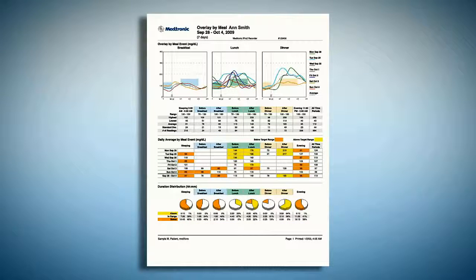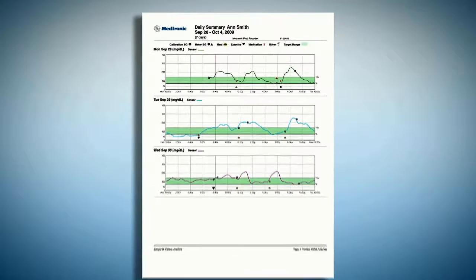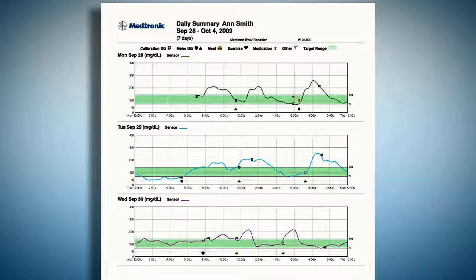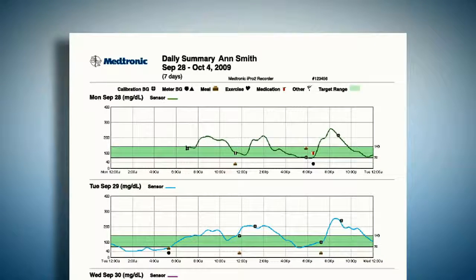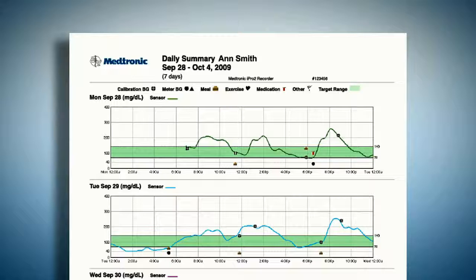The third report automatically generated is the Daily Summary report. This breaks out each individual day of the iPro 2 evaluation, showing the sensor tracing along with event markers for meals, medication, activity, and other. Here you can see the event that we entered for Ann. This report is especially useful for linking patient behavior to excursions. This concludes the iPro 2 specialist modules. Click here to take the test, or to review any of the other sections, choose from the top bar.